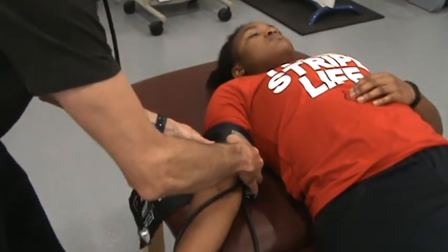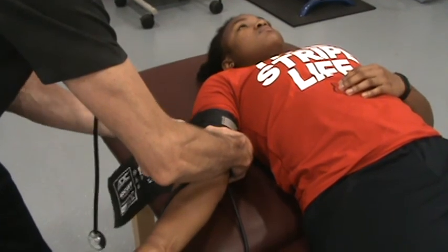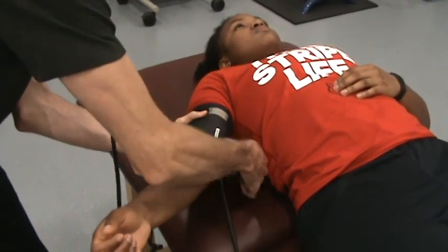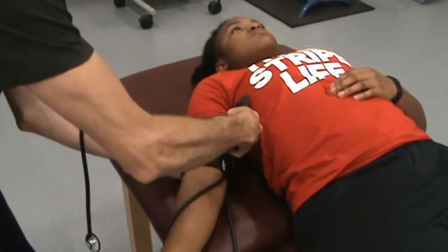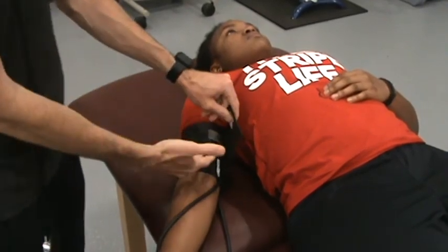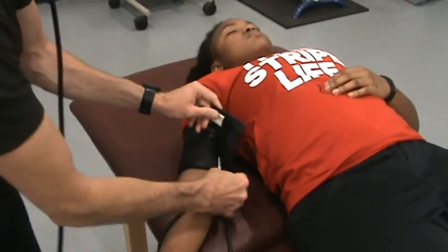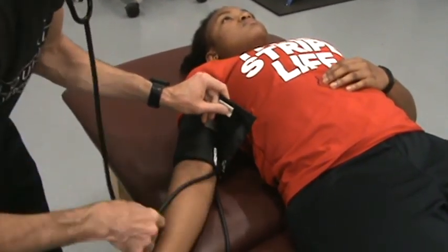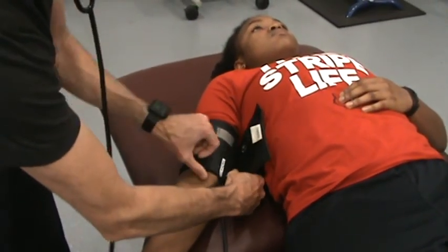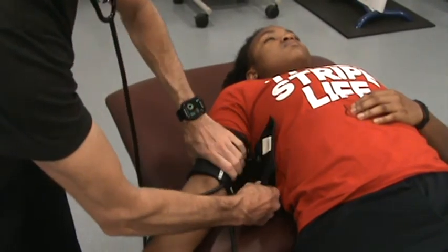I'm going to wrap the short side around first, then wrap my long side around using the Velcro. Once I get it where I want it, I'll have her rest again. You'll notice there's a little bit of overlap there, and that's okay. That just allows for different arm sizes. It looks like when I did that, the cuff moved slightly, so I'm going to loosen it just a bit and shift it around slightly to get it back over the artery.